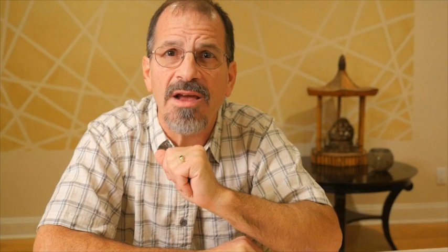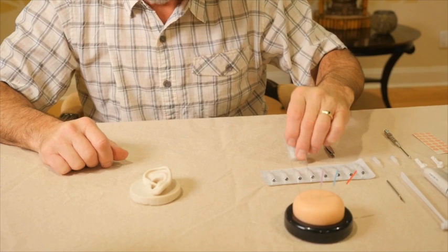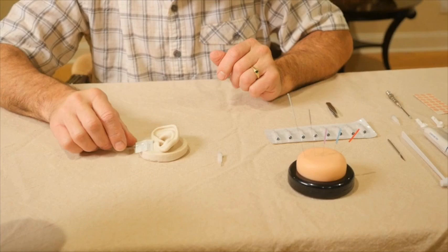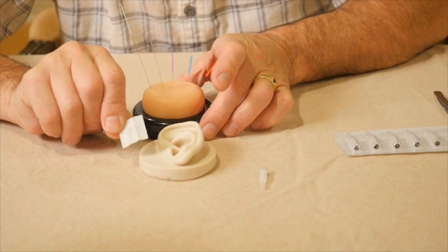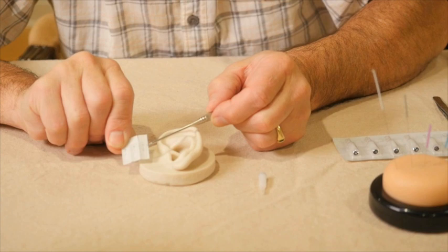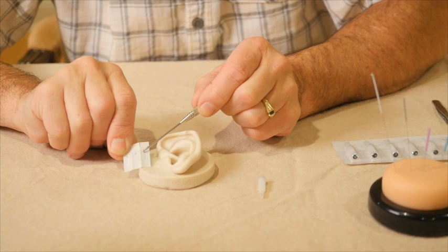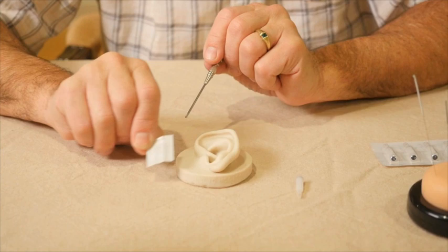The most common application for semi-permanent needles is ear acupuncture or auriculotherapy. The intradermal needle is the same number 1 thickness as the needle we looked at earlier, but it's a significantly shorter length — 6 millimeters — with a small circle at the top as a handle. The needle is curved to give you something to grip during insertion and to keep it from being over-inserted into the skin.